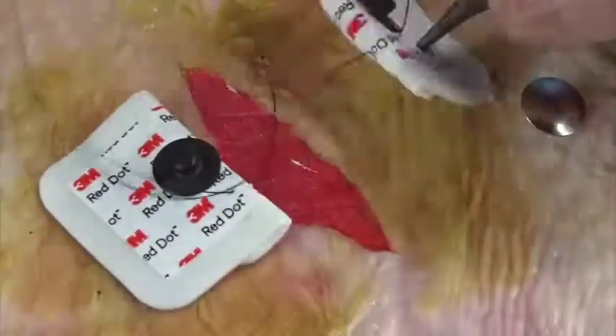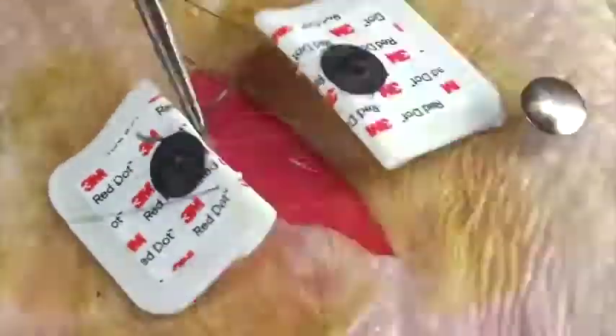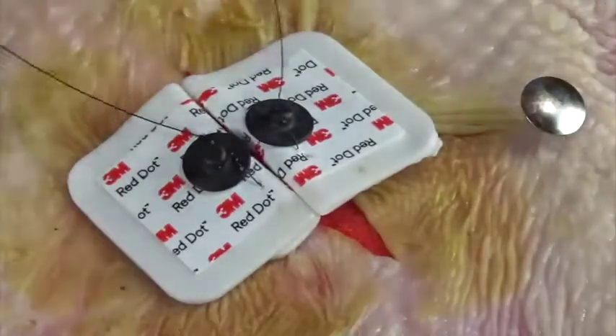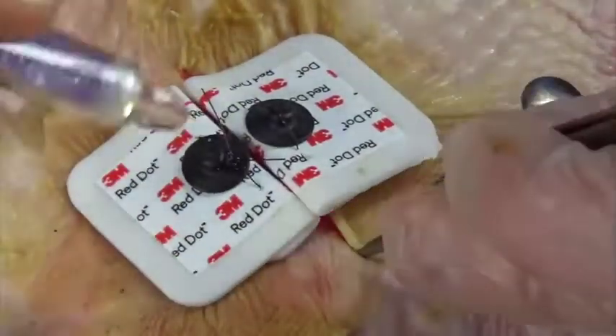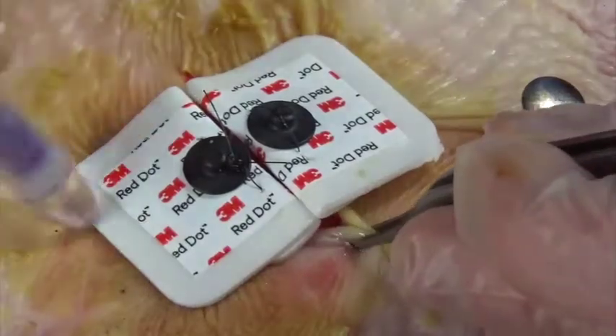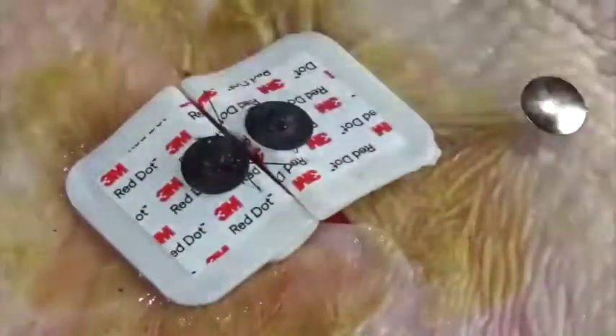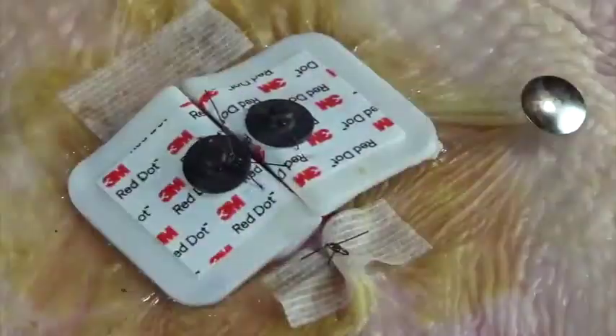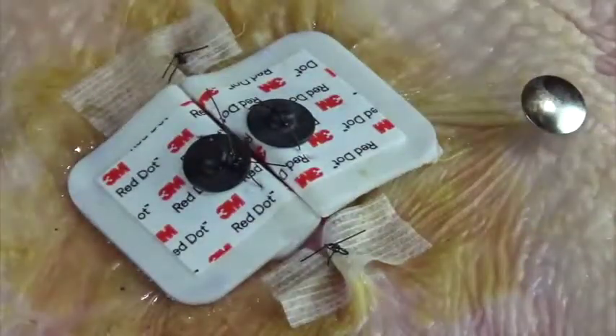Now you can suture through the rolled-over parts of the stickers. Depending on the wound, you can sew through the stickers and the skin or just the stickers — it's up to you. Now that all that tension is relieved, you can apply tissue glue to the wound margins and also to the monitor stickers so they'll stay in place longer. In addition to the glue, you could also put on some steristrips and even a suture or two if you want.